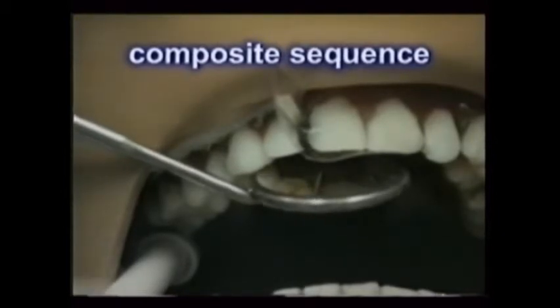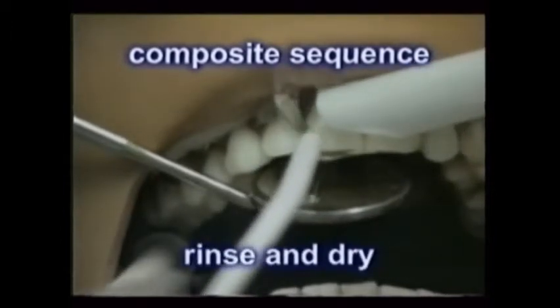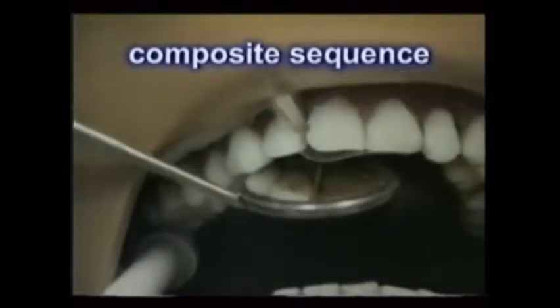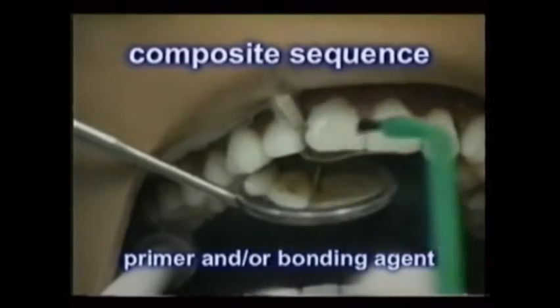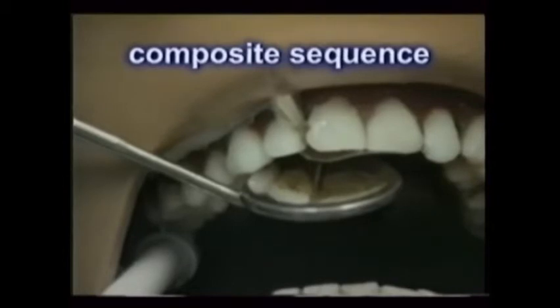The air water syringe is then used along with high-volume suction to rinse and dry the area. Depending on the composite material used, a wetting agent is placed on the dry dentin and enamel with another cotton pellet or brush, following the product's instructions. This is usually also light cured.